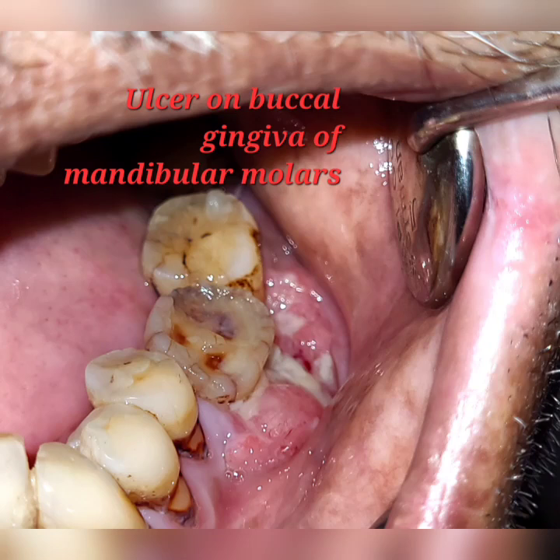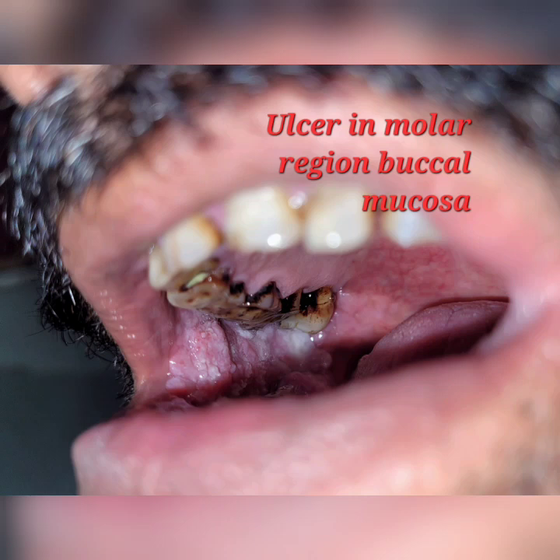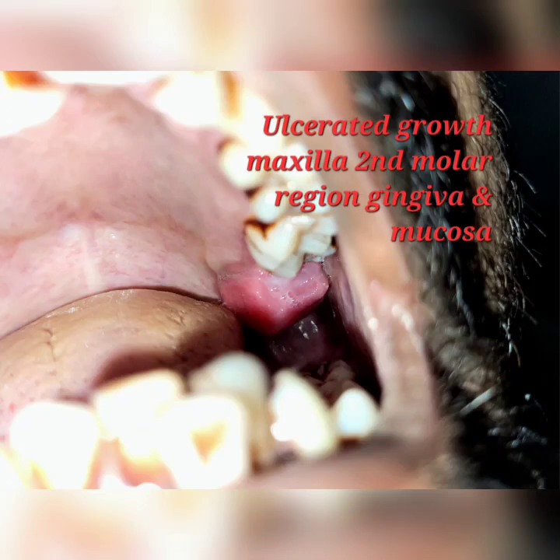local anesthesia. You all very well know that any lesion that is an ulcer, growth or swelling which is not responding to medical management for a month requires an incisional or excisional biopsy. Like any other minor oral surgery, thorough history taking, hematology as well as radiographic investigations are to be done to conclude differential and provisional clinical diagnosis.